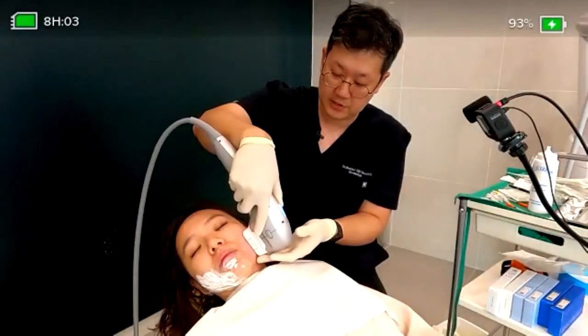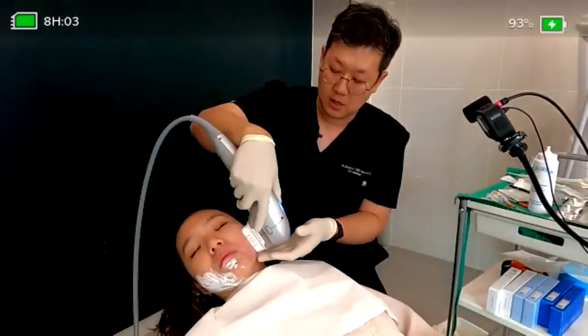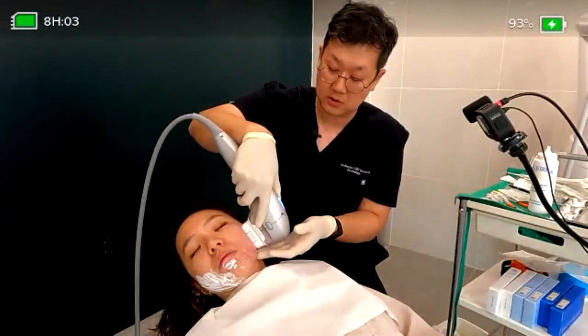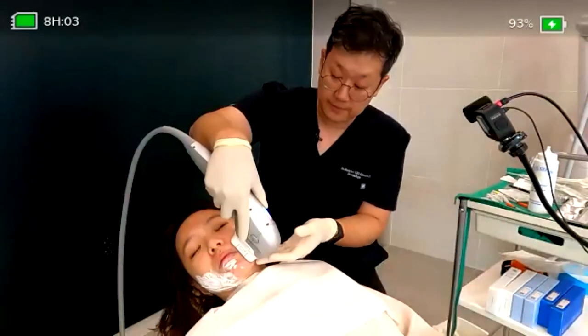If the patient is very sensitive to the pain, you can apply some numbing cream first, but some of the patients don't want that, and some of the patients really want that. So before we start, we can check with them.